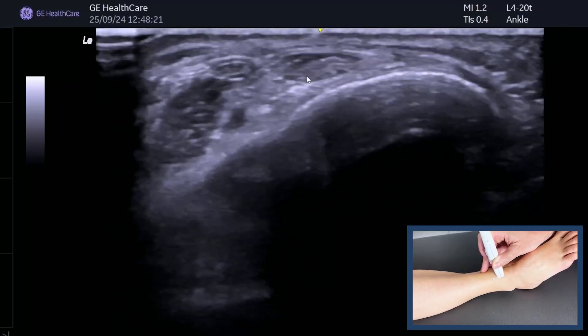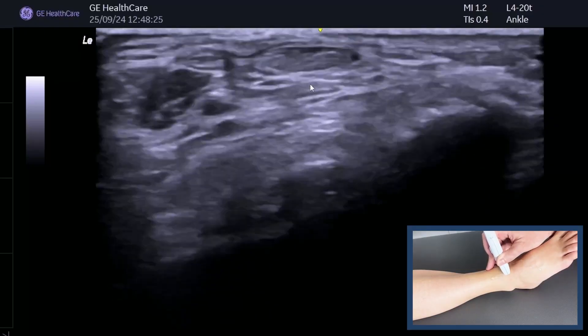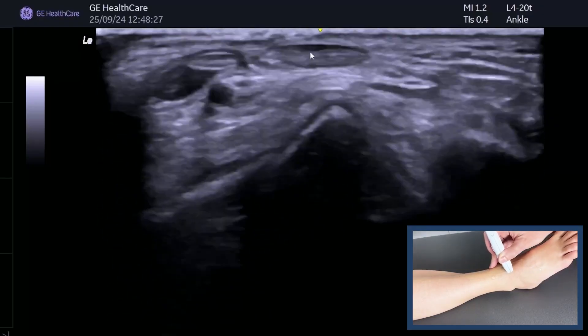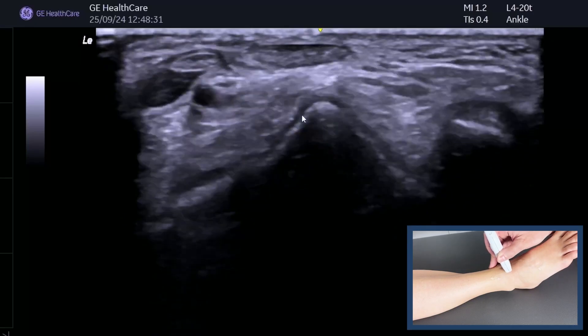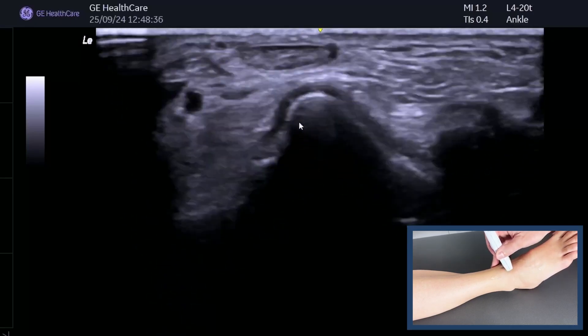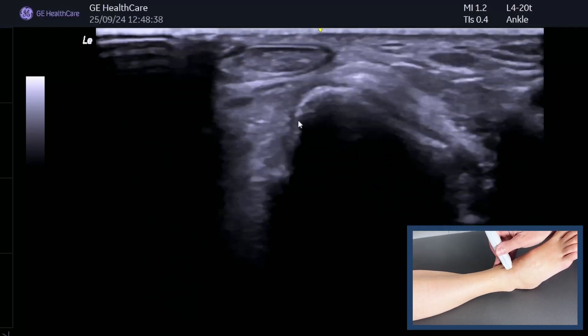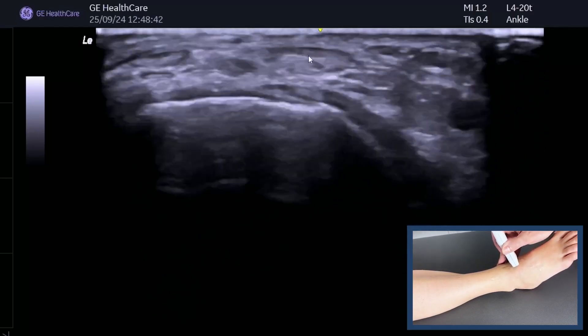Now it's just the tendon and we can follow that down really slowly — take your time, keep it in the middle, and remember it goes a little bit more medial than you think. There's the talar dome. How do we know it's the talar dome? Because it's got that nice pyramid shape and it's got articular cartilage on top.